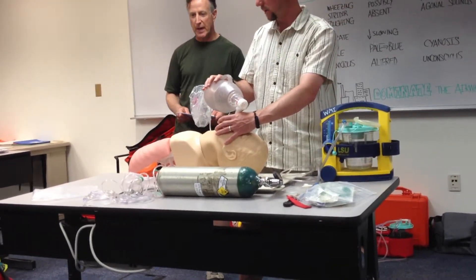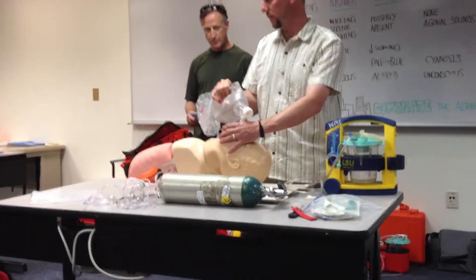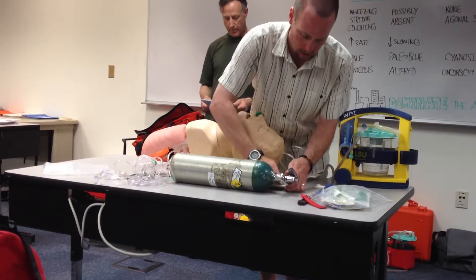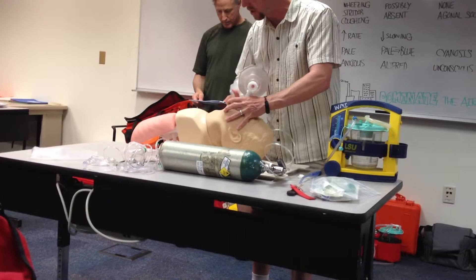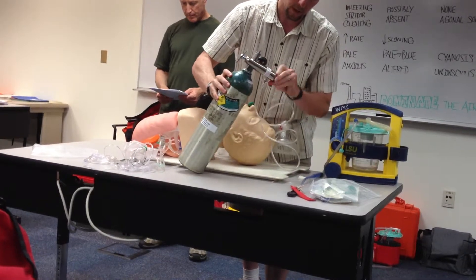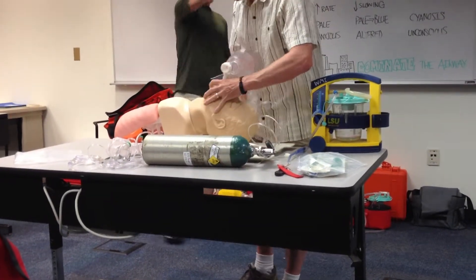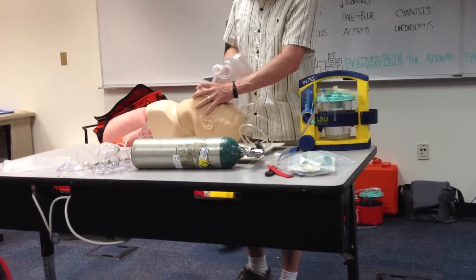So let's add some oxygen to that ventilation. I'm going to be sensitive to not going particularly long without any breathing. I'm plugged in, I'm going to give another breath, and turn it on. We're going to go up to a high flow — up to 15. Make sure I still have good positioning and a good seal.